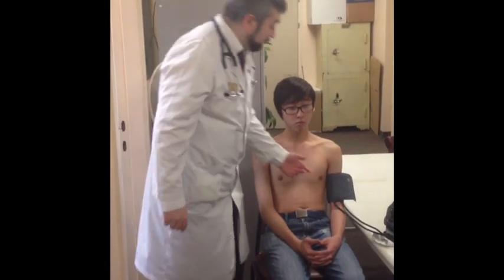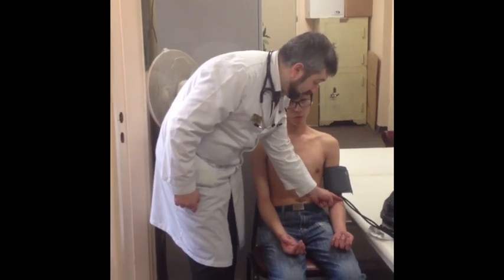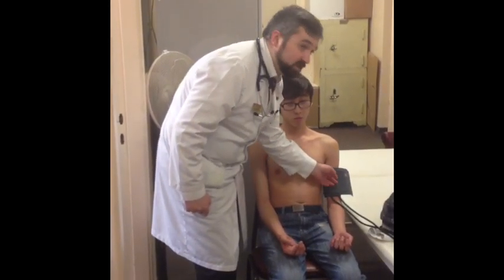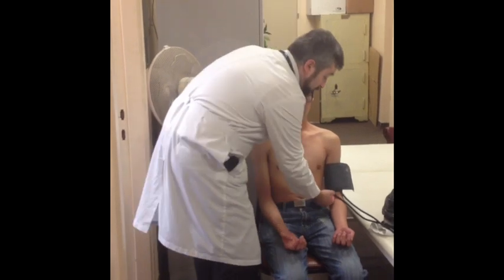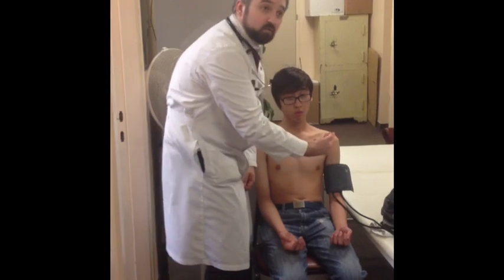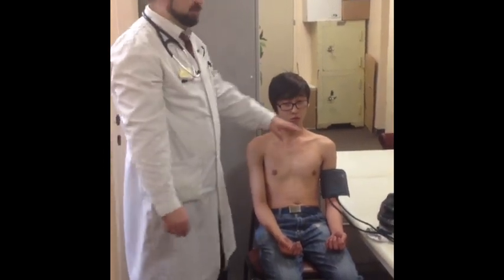You apply the cuff so that the lower border is two fingers above the elbow fold. It must be tight enough that you can put only two fingers under the cuff — not three, only two fingers should be able to pass under the cuff. This is the appropriate cuff position and application.